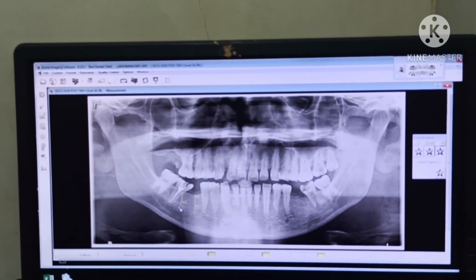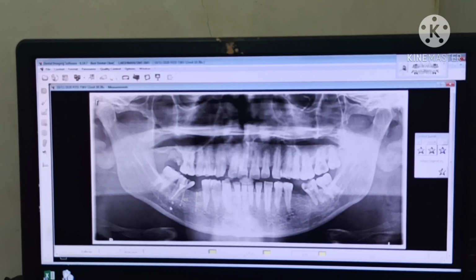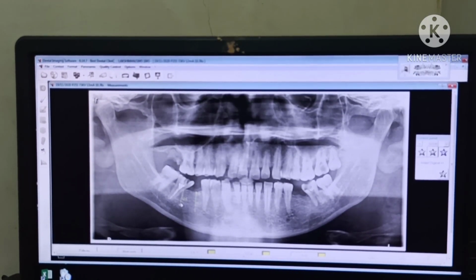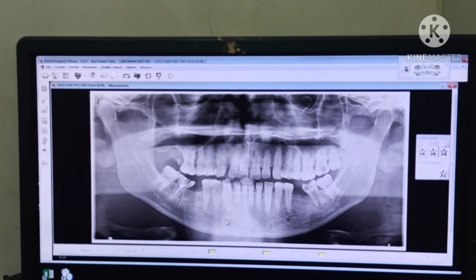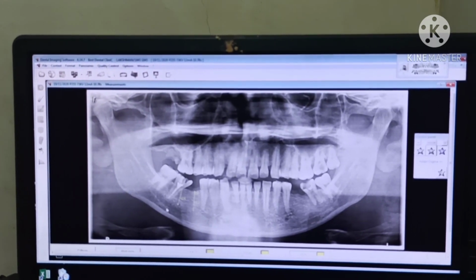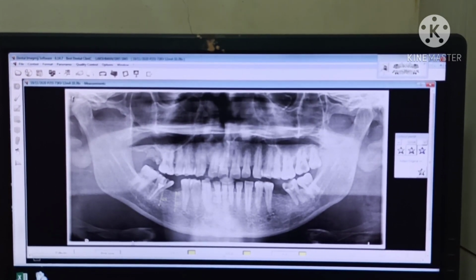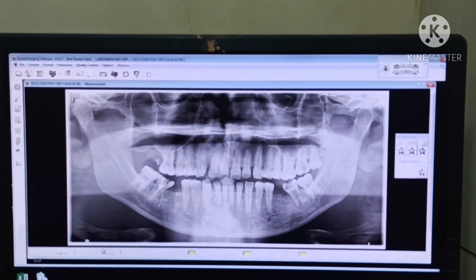The main thing is you have to check for the lingual ridge undercut, and you can get lingual engagement. That will increase the success. So 2 implants, mesially 4 into 10, distally 4 into 10. That is the tentative plan, right? So we will go to the left side now.